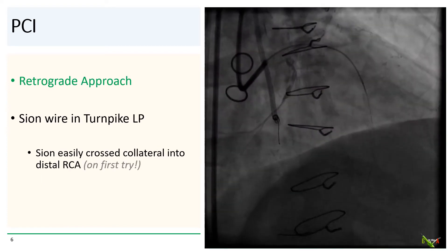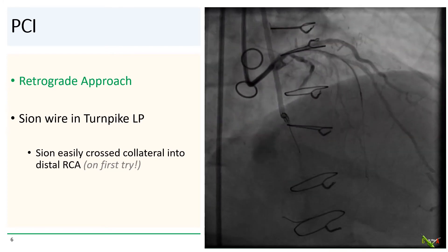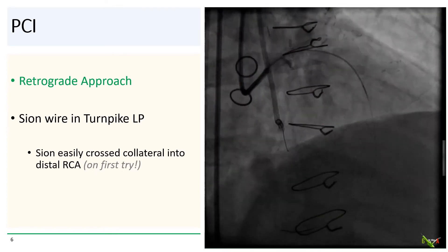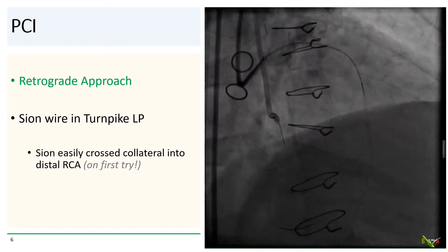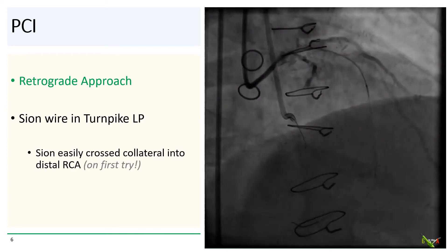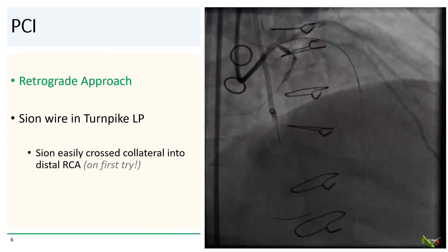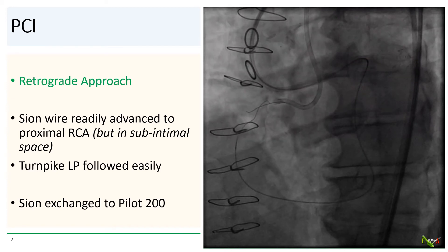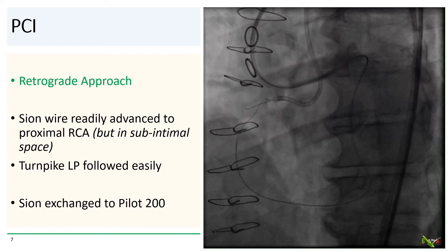So we switched over to retrograde. We used a workhorse BMW wire to engage the septal branch via a Turnpike LP microcatheter, then switched out to a Sion wire. We started septal surfing with the Sion, and on the very first septal we selected, the Sion quickly crossed into the PDA and then quickly up into the distal RCA. The Sion then readily tracked into the proximal RCA, but we could tell by the way it was wrapping that it was also in the subintimal space — it had dissected in the retrograde direction as well. We left it there. The Turnpike LP microcatheter then tracked fairly easily with just a little torquing to get it to turn into the PDA from the septal collateral.